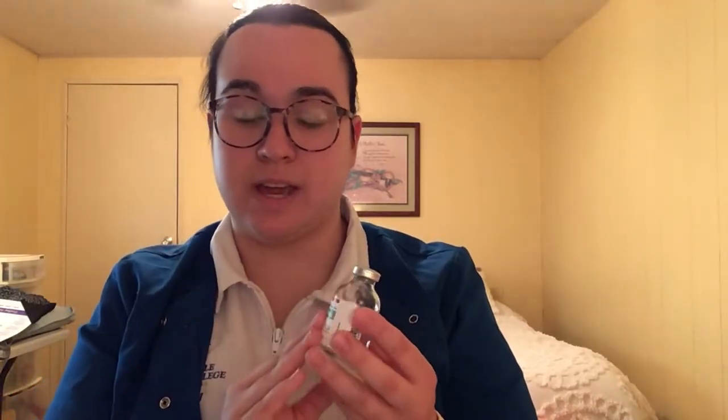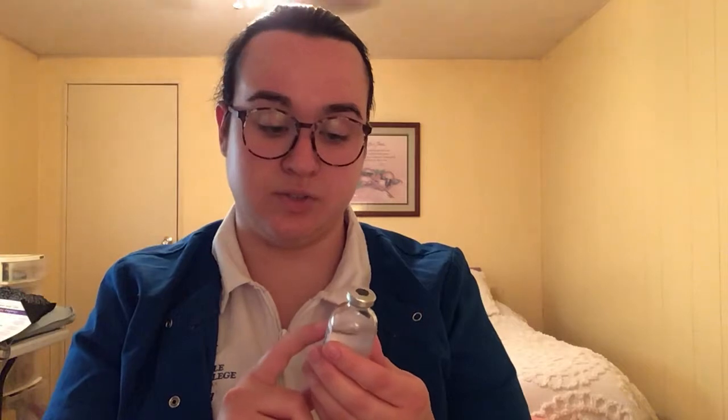And for the B12, I already checked the expiration date, and I would make sure that my initials, date, and time are on this vial if I was opening it for the first time, or I would check and make sure that somebody else's initials, date, and time are on there, and add my date and time on there as well for the next use.